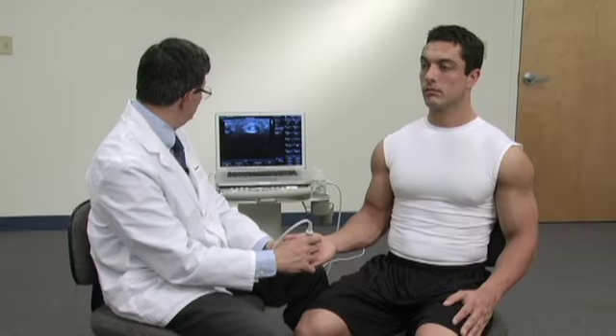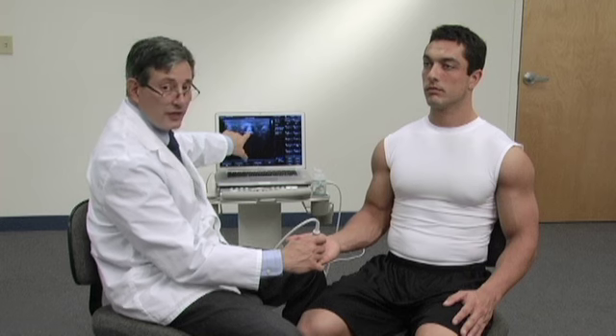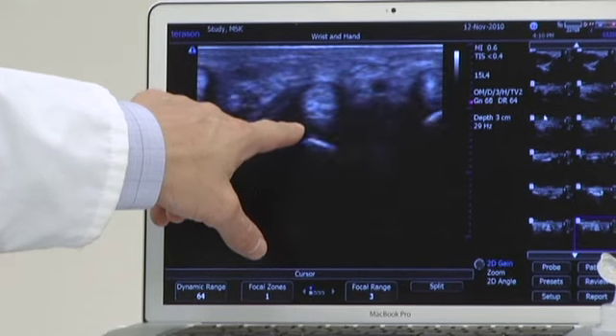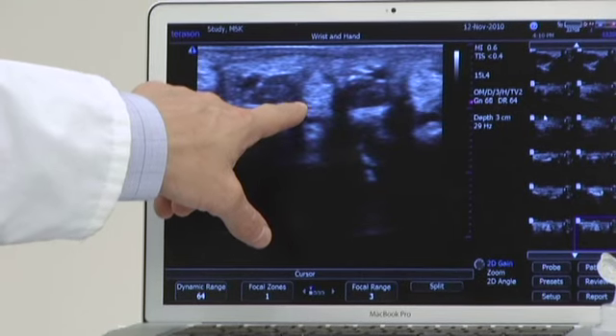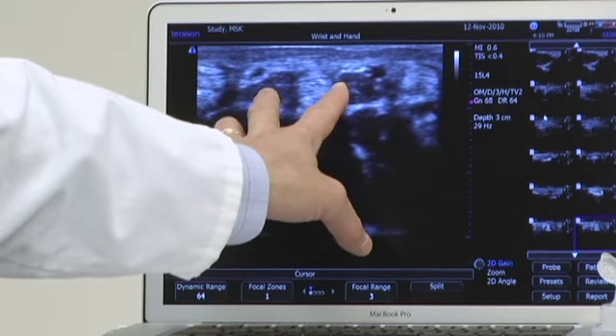On transverse, what we're going to see is this. There's the tendon — the flexor tendons of the third finger. As I move proximally, you'll see the tendon as a bright structure, with muscles to either side.